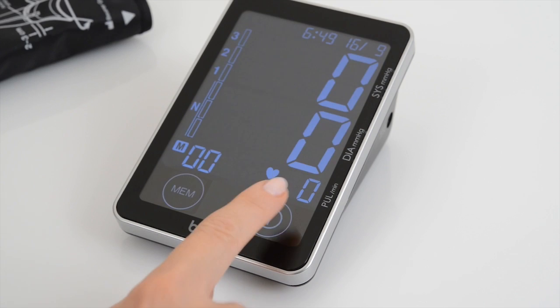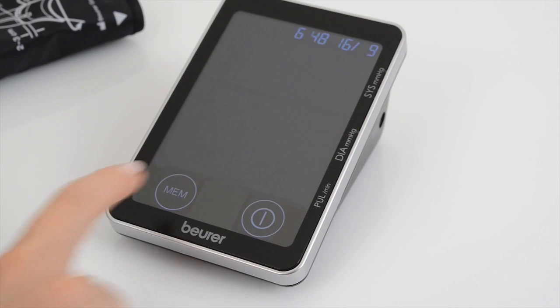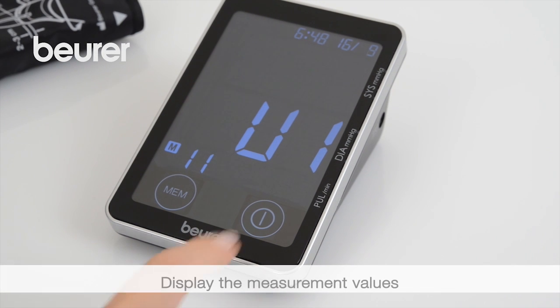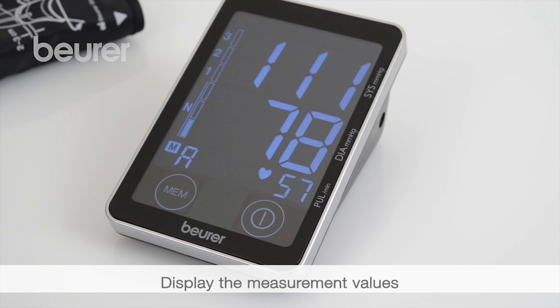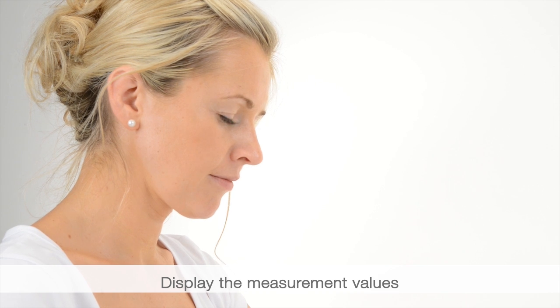Displaying and deleting measurement values: switch on the device. Press the MEM button and select the user memory by pressing start stop. Then press MEM repeatedly. The average value of all stored measurement values appears.